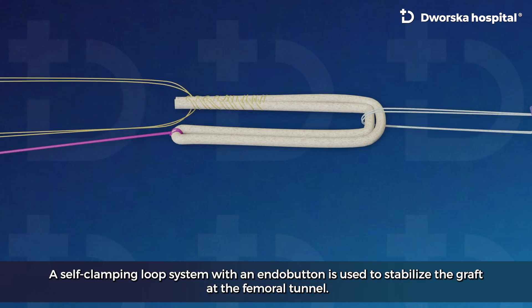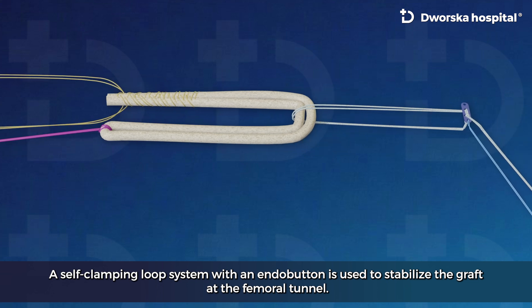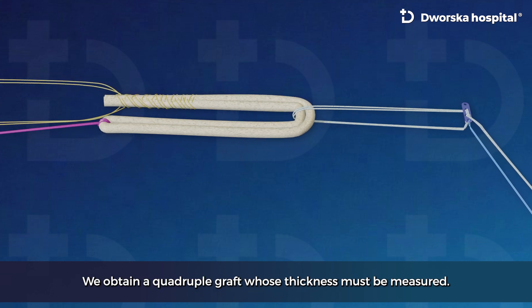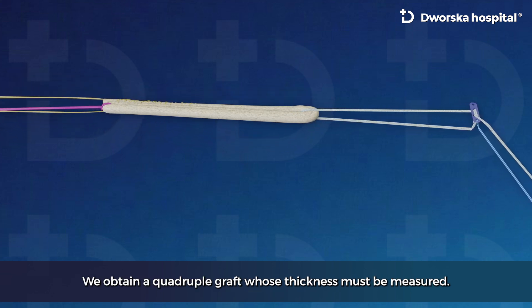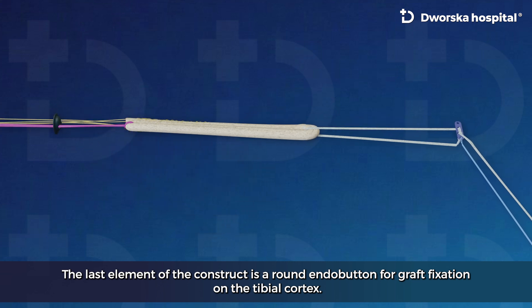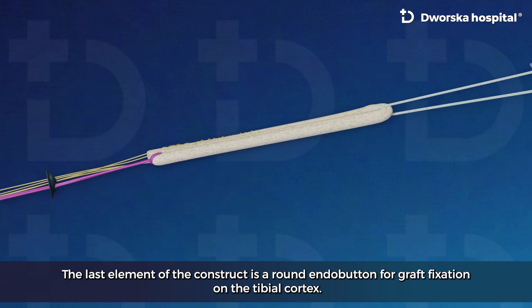A self-clamping loop system with an endo button is used to stabilize the graft at the femoral tunnel. We obtain a quadruple graft whose thickness must be measured. The last element of the construct is a round endo button for graft fixation on the tibial cortex.